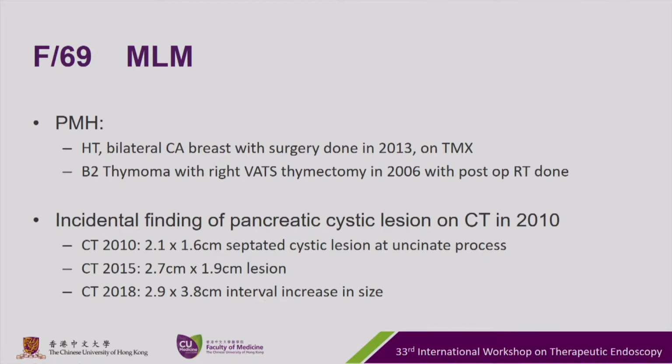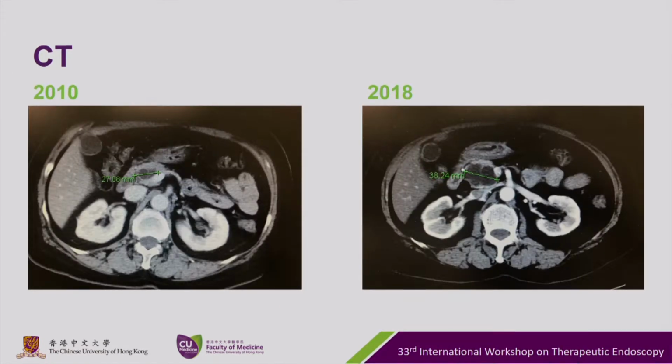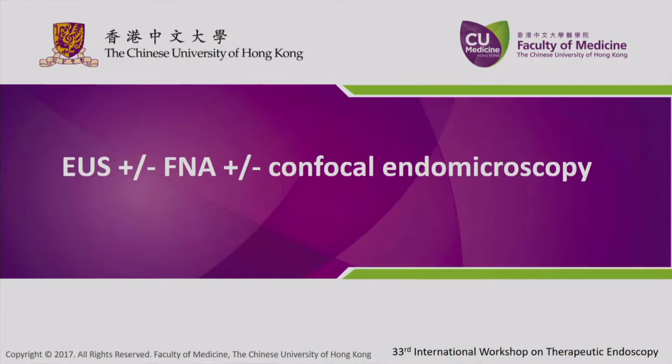2.9 by 3.8 centimeter cystic lesion. And this slide shows the difference in the sizes of the pancreatic lesion. And today we'll be performing an endoscopic ultrasound with fine needle aspiration and also confocal endomicroscopy.